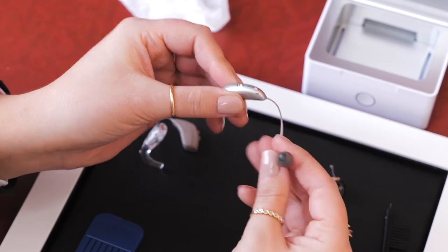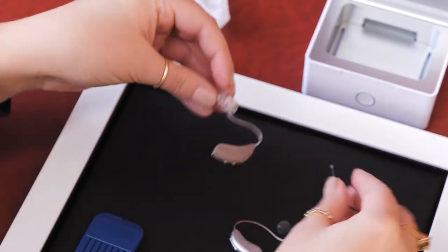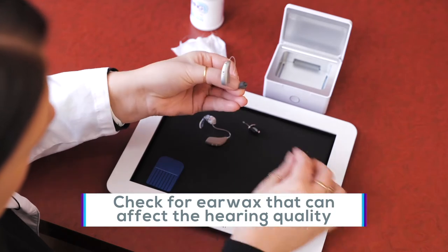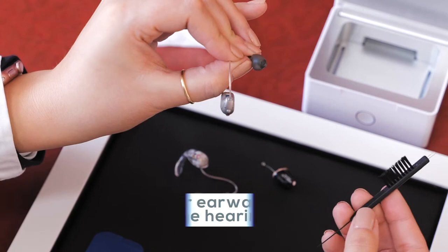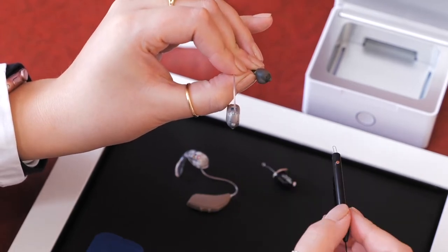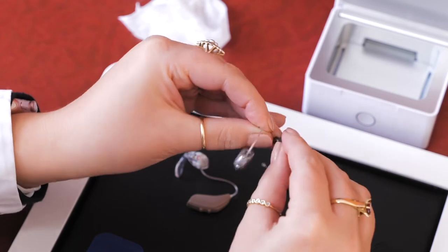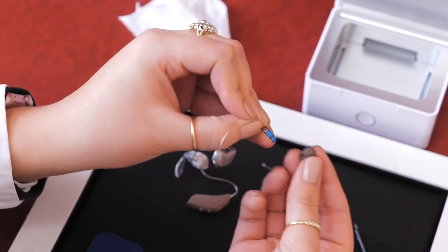The next thing we can do is check the part that goes into your ear — whether it's a dome like this, a custom ear mold, or even a custom hearing aid. We want to check and see if there is any wax that could be causing the hearing aids to sound quieter or maybe just not as clear. With domes, they have a small hole at the tip that can collect earwax. Take that same brush and gently see if you can get the earwax out. You can also take the dome off and run it under some warm water, squishing it all around to help get it clean as well.